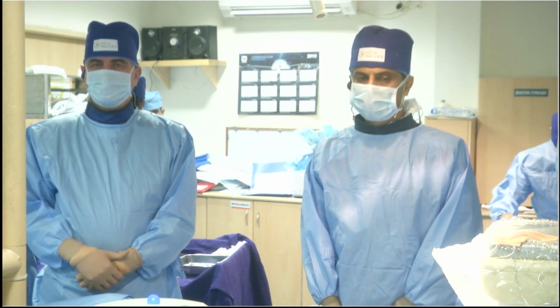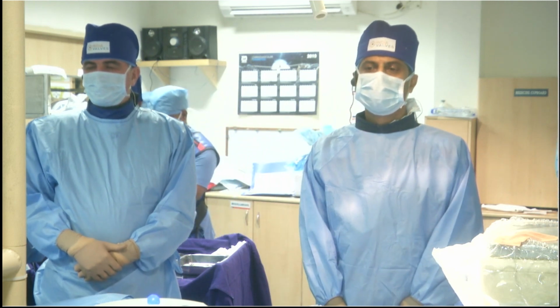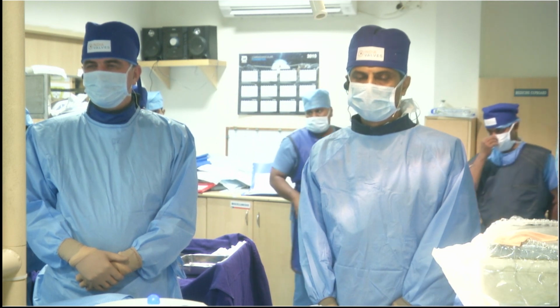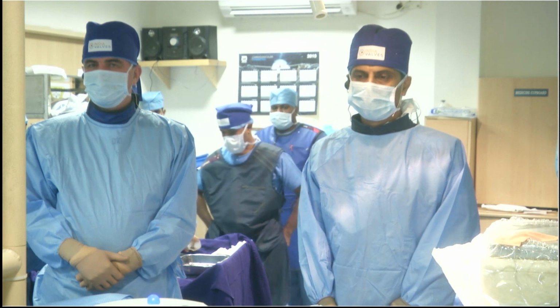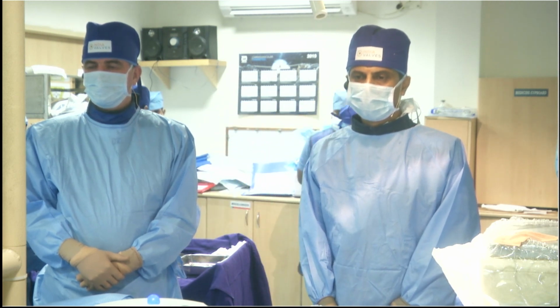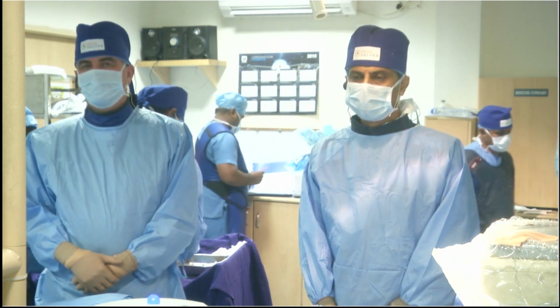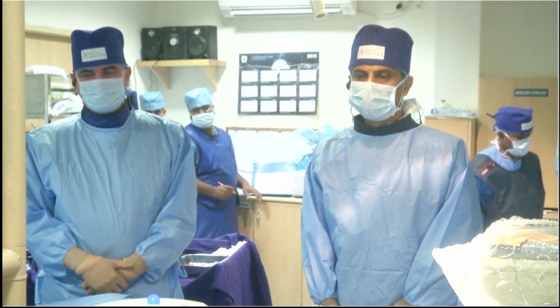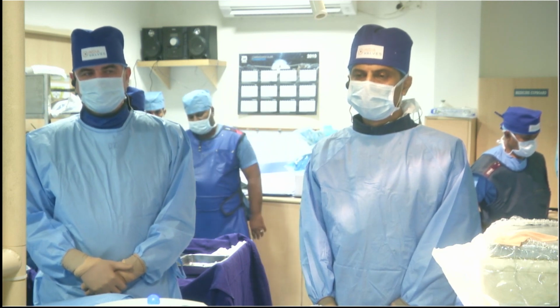Okay, perfect. The case is a 75-year-old female with asymptomatic severe aortic stenosis, and a recent admission for unstable angina. Coronary angiogram was done: LAD mid 70% stenosis and 60% stenosis in the PDA. We also found severe calcified aortic stenosis with normal LV function, and the STS surgical score is 2.7.